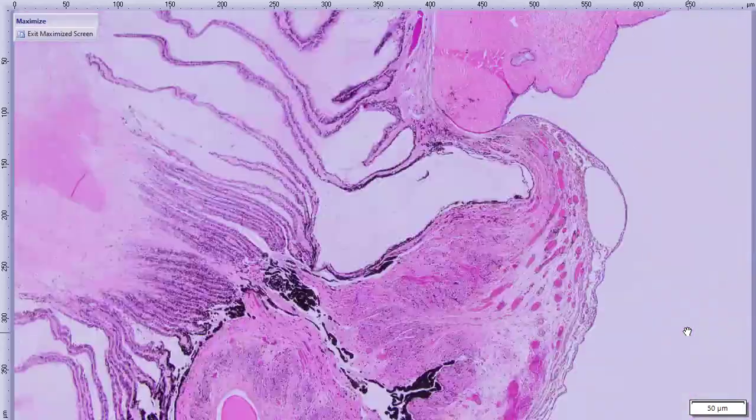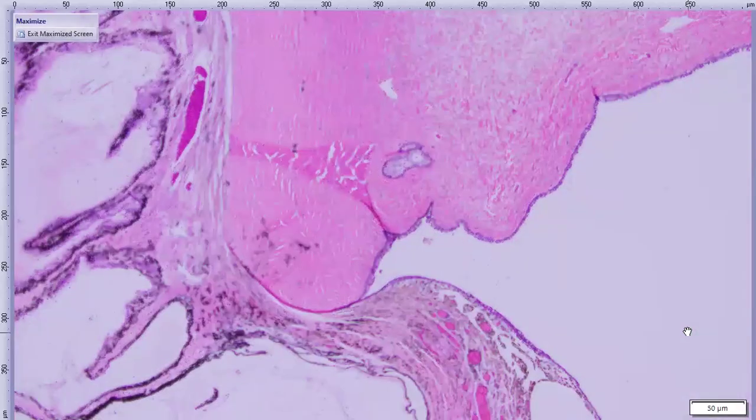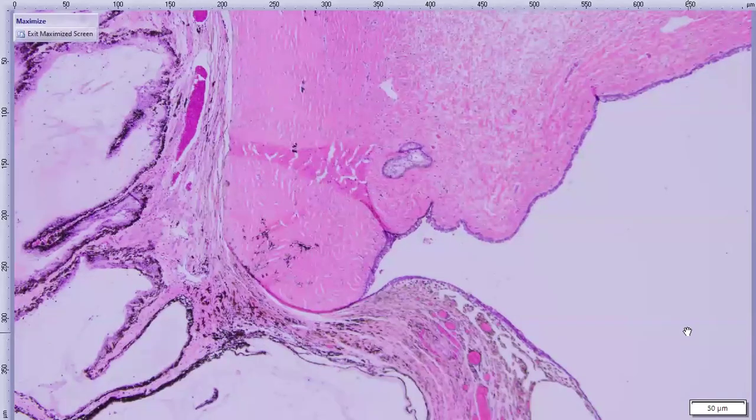Ultimately, when we have a complete absence of the cornea in cases like this in young kittens, the suspicion is that the cornea became necrotic at some point early in life and is basically just gone for that reason. And most likely this is associated with viral infection in the kitten early in life, especially herpes virus, but also as published by Coplow, cases of calicivirus can look like this as well. So the idea is that the cornea becomes extensively necrotic early in life. It's just gone. The iris prolapses and reepithelializes.